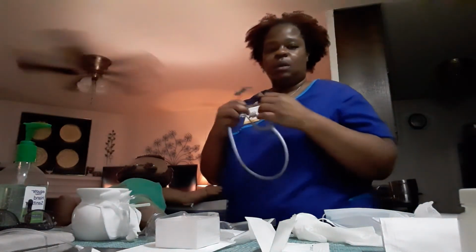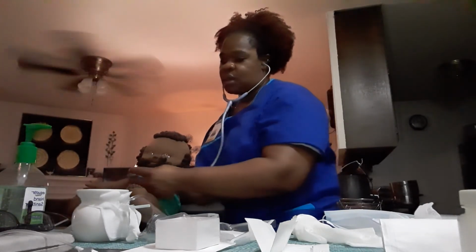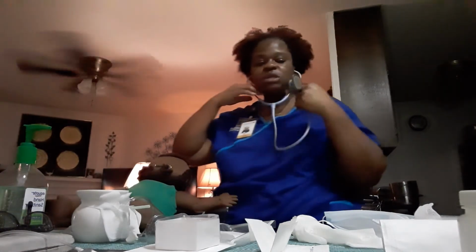I'm going to reassess the patient. I'm looking at his oxygen levels. Oxygen is good. I'm going to re-auscultate his lungs. Lung sounds are clear, so I'm going to turn this oxygen back down. So I've cleaned all this up.